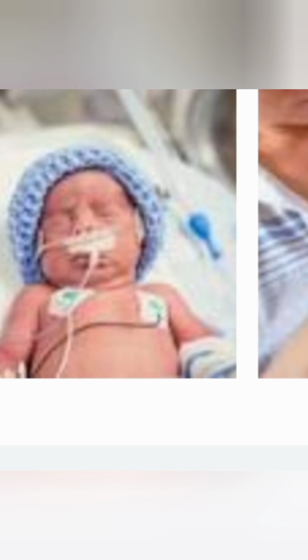the sick child. Now we will discuss about the oxygen by mask. It is a very useful method. I think everybody knows this method. Why? Because whenever the patient needs oxygen, we will put oxygen by mask. When we want to administer oxygen to babies and children, it is a very useful method, giving oxygen by the face mask. And the size of the mask should be checked before giving the oxygen by the mask. The mask should be well fitted over the nose and mouth. Why? Because to prevent escape of oxygen and to prevent discomfort.